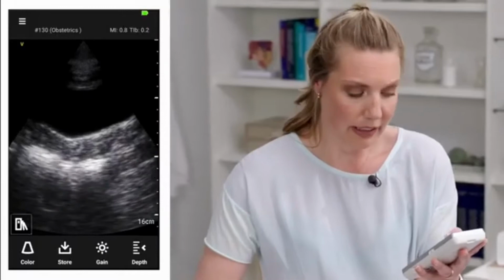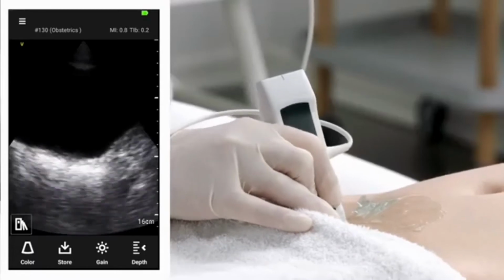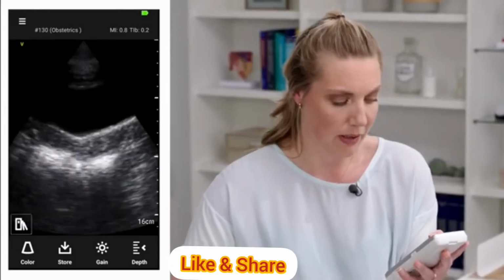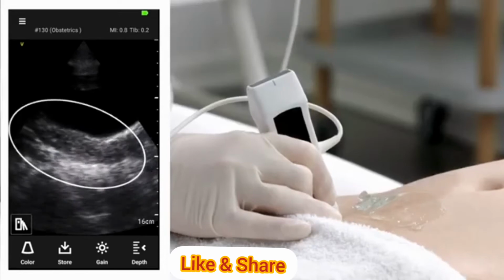Again, we're tilting the transducer, but now on a horizontal axis, from the left side of the woman to the right side, so that we're sure that we've seen the full uterus. This is important. Now we see the uterus and it's empty.